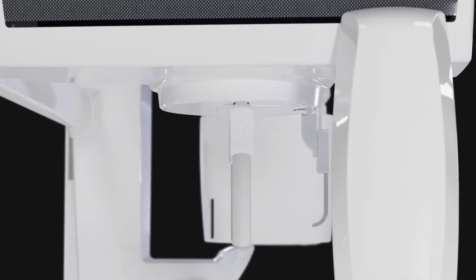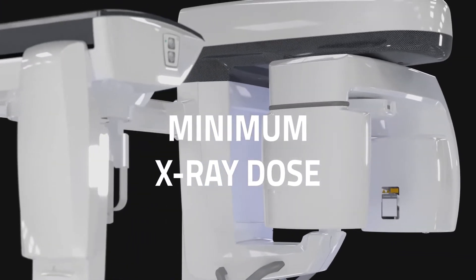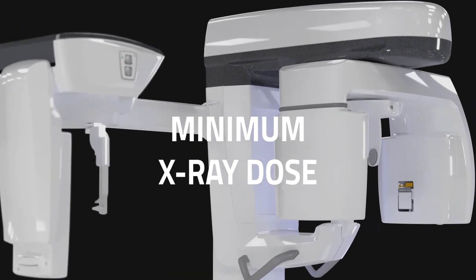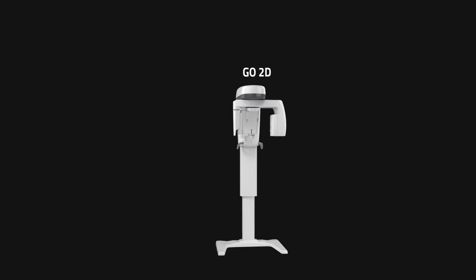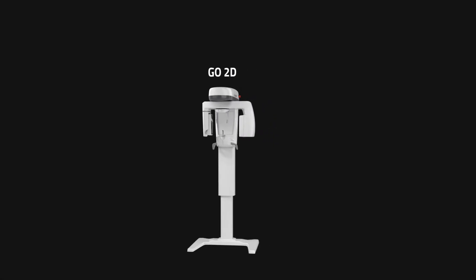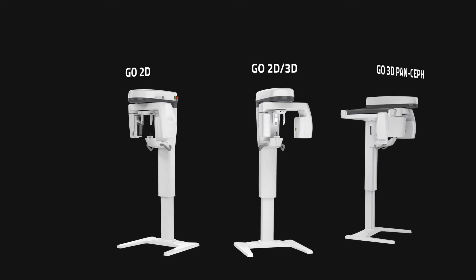NewTom Go brings you within reach of the best imaging technologies, cutting-edge protocols, ensuring patient safety, and countless ways to connect and optimize your workflow. NewTom Go is a flexible platform ready to integrate a teleradiographic arm in 2D or 3D configuration.